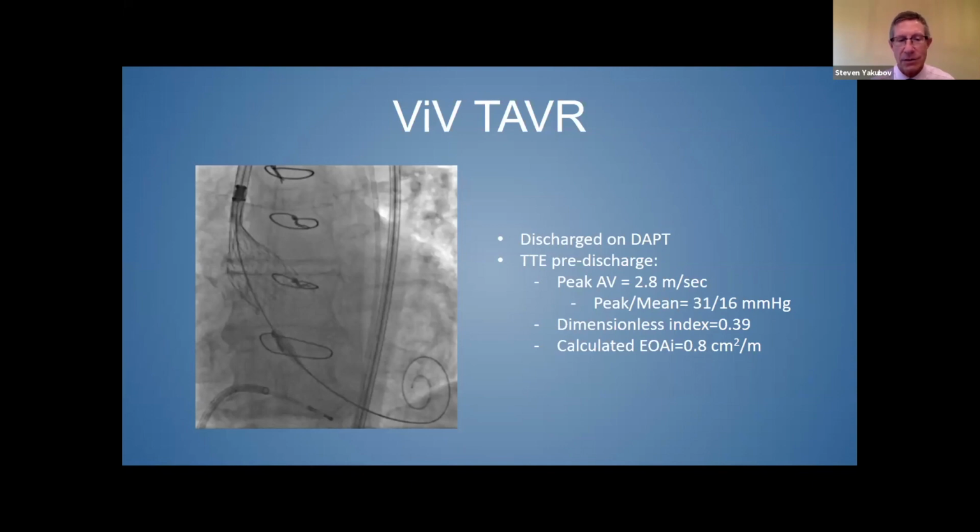But I love to put this valve out as big as possible, and even if it's non-fracturable, I'll still post-dilate this, and I depend on my catheter gradients in the cath lab more so than the echo gradients. I wanted to know if Joel thinks that's a reasonable thing to do. I'm trying to walk away with the lowest possible gradient in the lab, so I'm going to post-dilate even if I have a decent result like this.